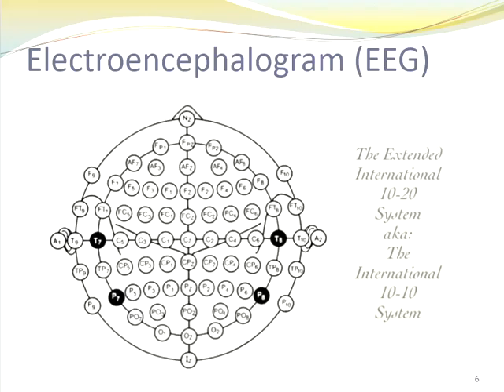Typically for EEG, we do 21 points. For sleep, we do even less than that, which is beautiful. But what's really nice about the 10-20 system is that it has the ability to add on more. So this is like a very extended version.